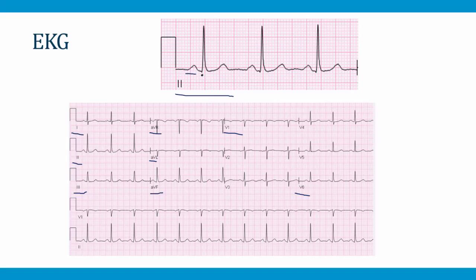You can see a P wave, a QRS complex, and a T wave, and then there's a pause, and then it happens over and over again. And many times an EKG lead will have a couple of so-called rhythm strips along the bottom, like what's shown here. In a rhythm strip, you pick a lead, for example V1 or lead 2, and you just show multiple beats in a row.